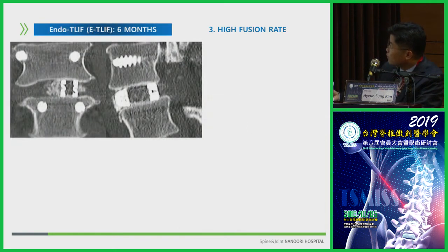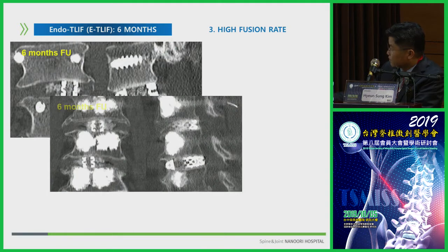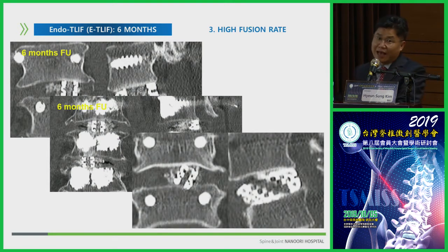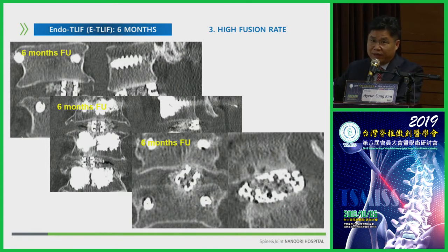But in the endoscopic fusion cases, you can see here immediate postoperative and 6 months later. Actually, this case is a two-level severe osteoporosis case, because I performed cement augmentation. But in spite of the osteoporosis, 6 months later you can see there is still no subsidence and we can obtain a good fusion. In these cases, I first inserted a 14 cage because there was some subsidence immediately after the operation, but 6 months later you can see no more aggravation of subsidence. This means that keeping the endplate under the endoscopic view and inserting a 3D printing cage can achieve a very good fusion rate.